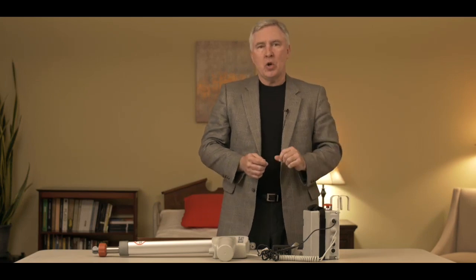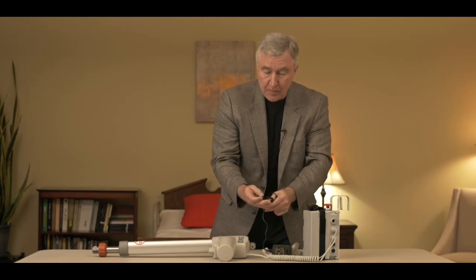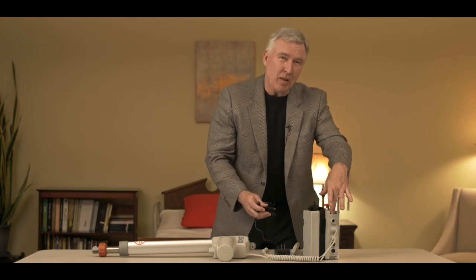So what happens if you plugged this into the wall and the lights didn't show up? What could be wrong? Well, a couple of things. The adapter could be bad — if it's broken you're not going to get power to charge it up. Another possibility could be the charger. And don't forget, if the emergency stop button is pressed, the lift won't charge.